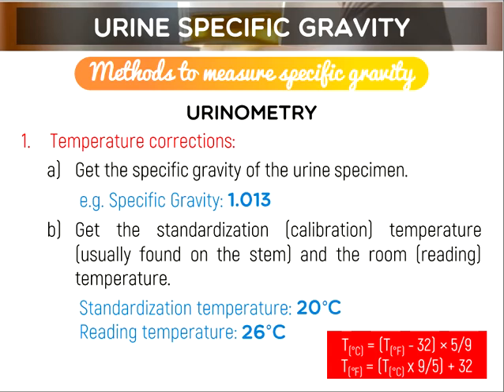For example, the standardization temperature is 20 and your room temperature is 26. To convert Celsius to Fahrenheit, there is a solution for that.